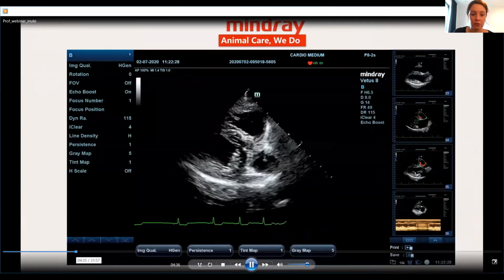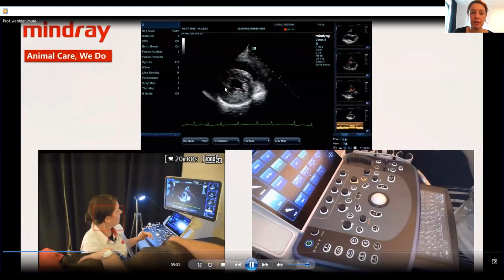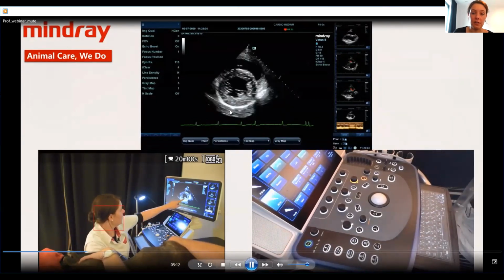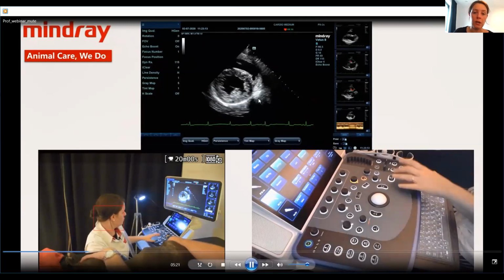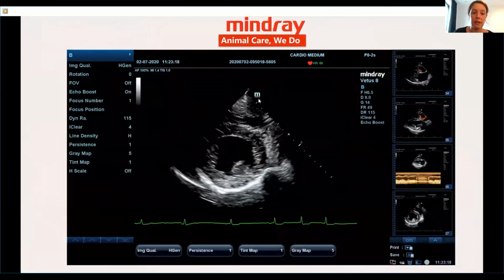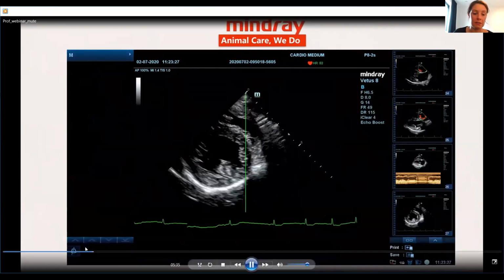So then we go on to our short axis view at the level of the papillary muscles. You see again, she's moving and breathing. Here are the papillary muscles, here and here, the lumen of the left ventricle, and above we see the right ventricle. Every now and then I tilt my probe a little bit like this, and you can see the mitral valve coming into view. That helps to decide where to put your M-mode cursor, because you want to be in between the papillary muscle and the mitral valve.